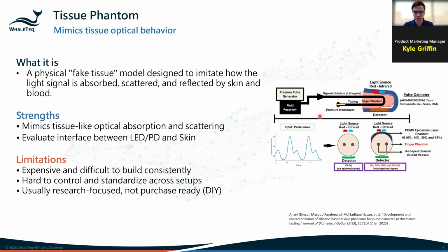And since this is a do-it-yourself testing approach, you'd also have to develop the pulse wave as well.